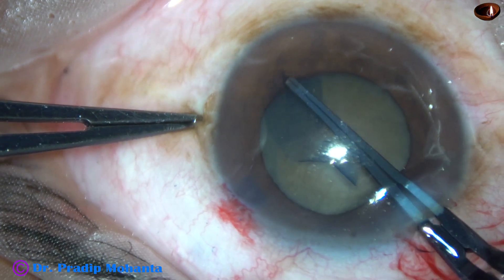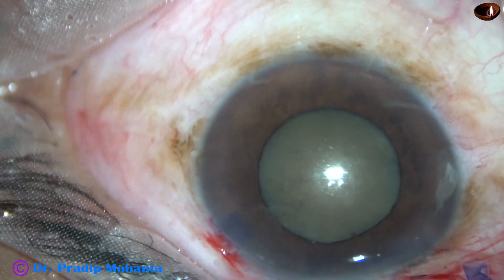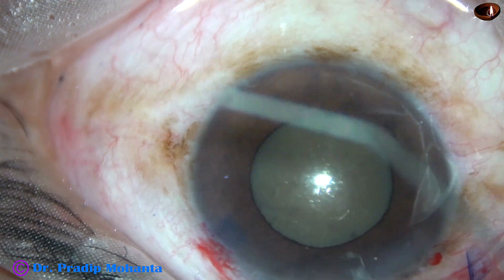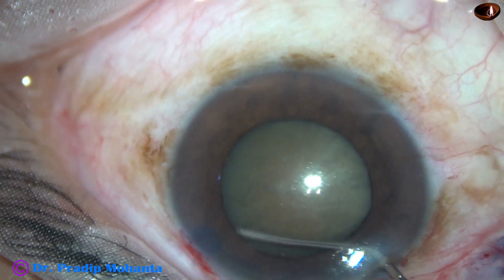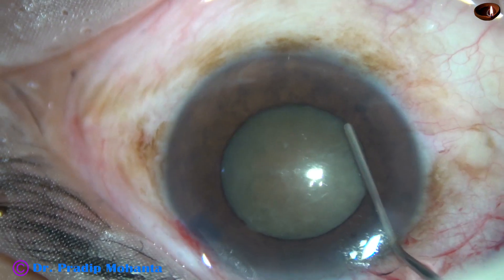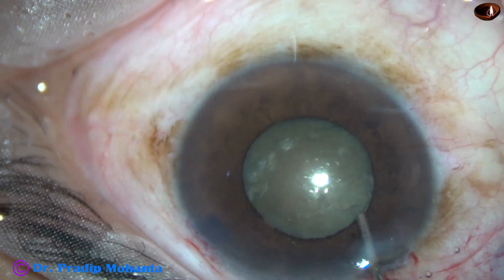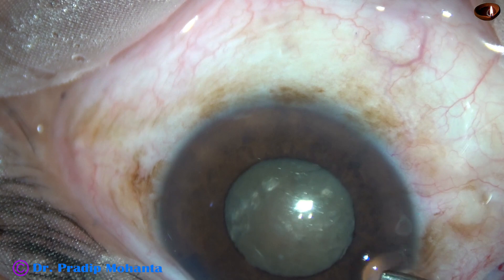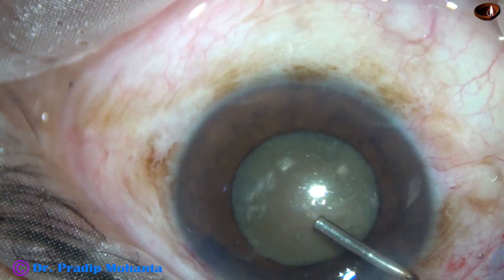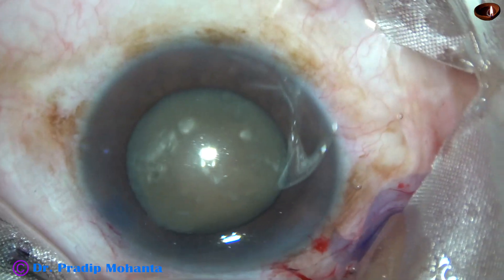At this moment the capsulorhexis is being done, and it has been a very good, adequate-sized rhexis. Just after the rhexis, the pupil has started constricting — the size of the pupil at this moment is about 5 mm. And as I touch the iris, as I rotate, and as the intraocular pressure decreases by egress of fluid, the pupil constricts. So this is going to be a tough case.